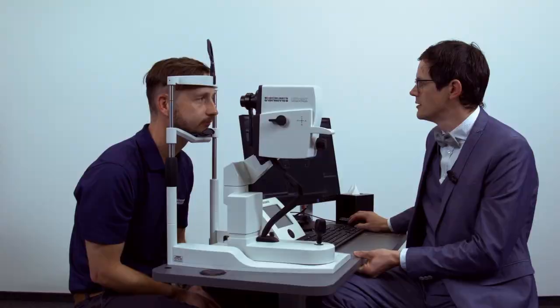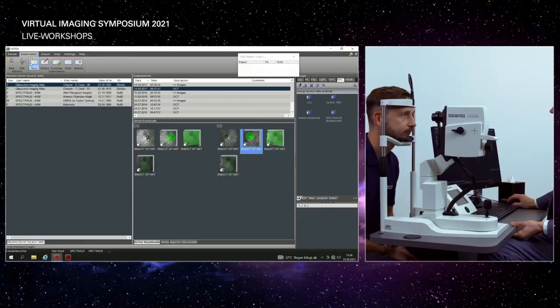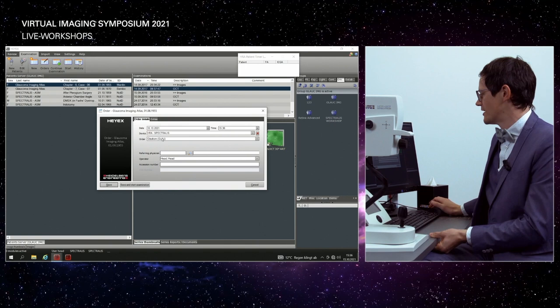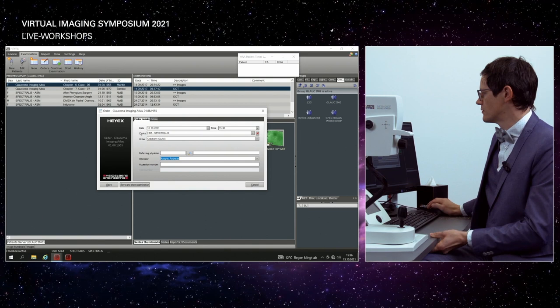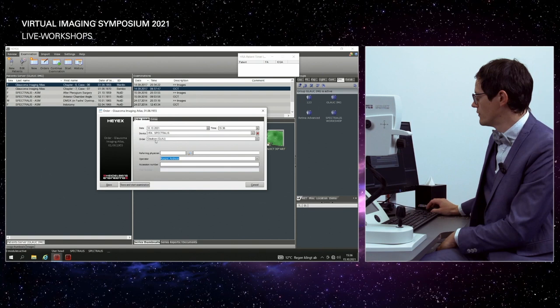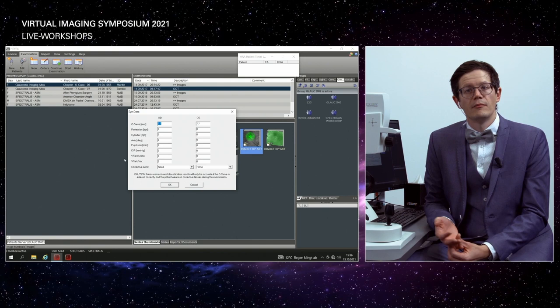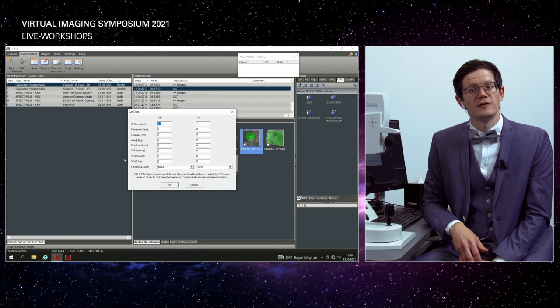Thank you Matthias. Without losing time, we will immediately start with my colleague Henry and show you the glaucoma examination. What I first do is start the scan — I place the order, selecting 'glaucoma' in Germany, set the operator name, save and start. Before we start the glaucoma module premium edition, we normally want you to type in the corneal curvature of your patient's cornea.